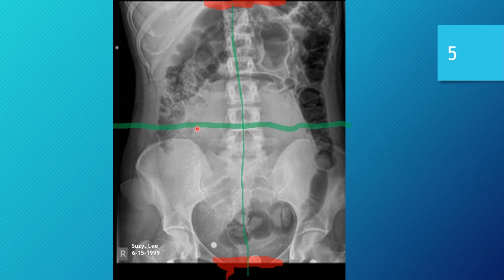As I said, this image does need to be adjusted inferiorly just slightly. I think that when they made their central ray alignment to the image receptor, inferior superiorly, they went just a bit above the iliac crest, and that's where we got that cut off on the bladder. So that needs to be adjusted, and the image will be good for positioning.